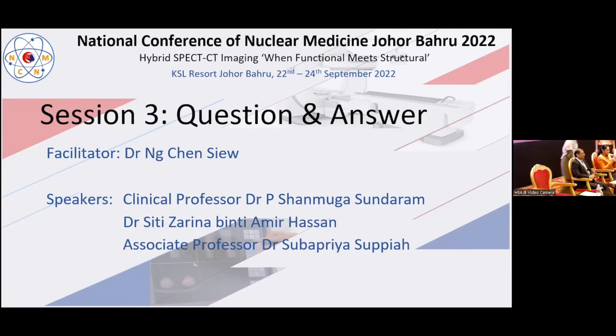Thank you for the question, Dr. Siti Zarina. So it's a pertinent question where we actually measured the SUV max in the liver, but we didn't measure in the mediastinum. Maybe future studies can measure the mediastinum, but the liver uptake is definitely higher. And so we have to then be alert. If we are using contrast-enhanced scans, we still report based on the Deauville criteria, whether it's higher than the liver or not.